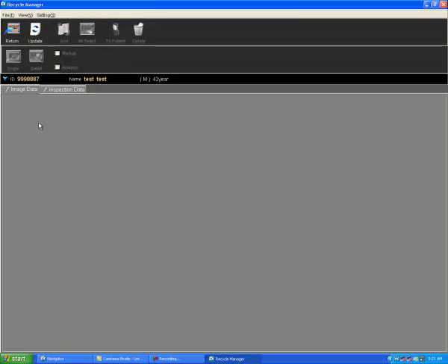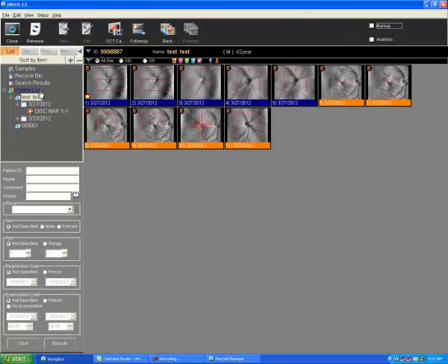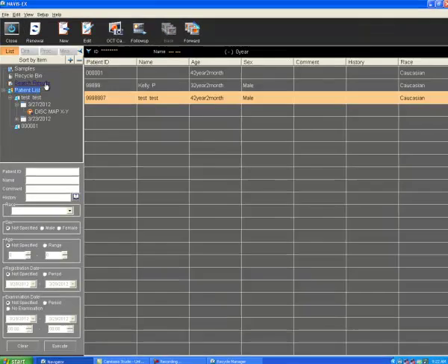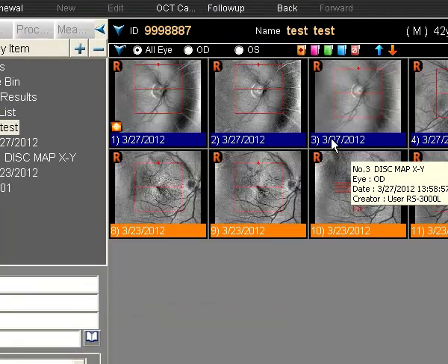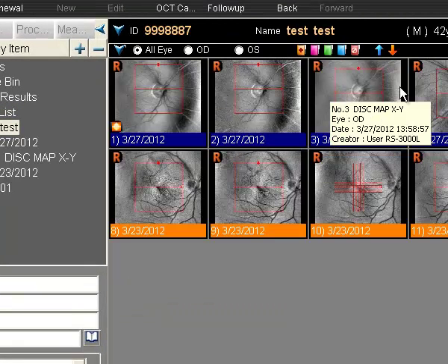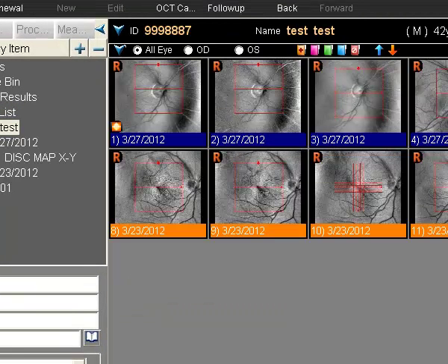We'll now see that the recycle manager is empty. If I return and open up patient test test, you'll see that not only are the three disc maps there, all the scans are now there within this patient. So it is all ready.